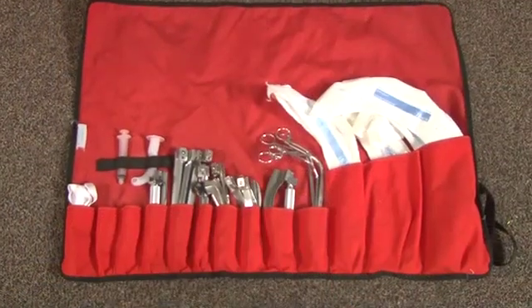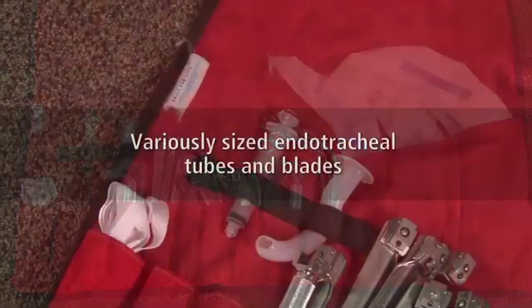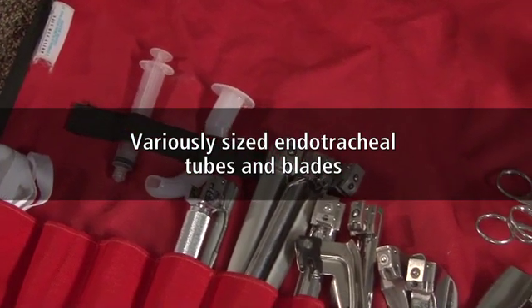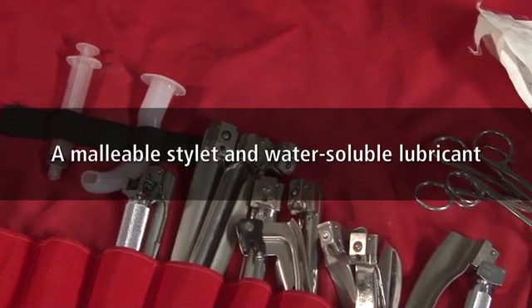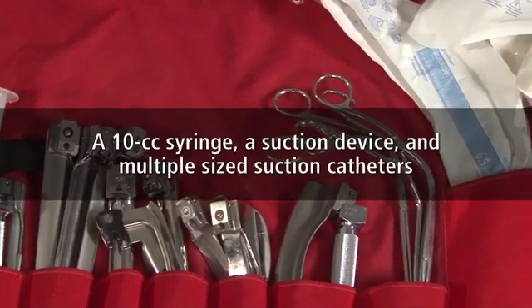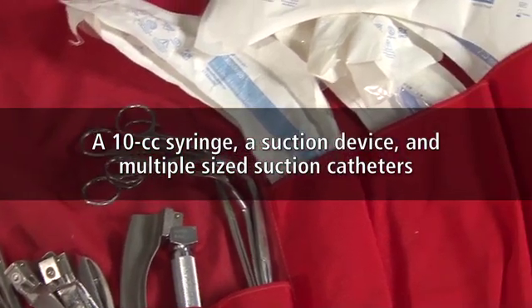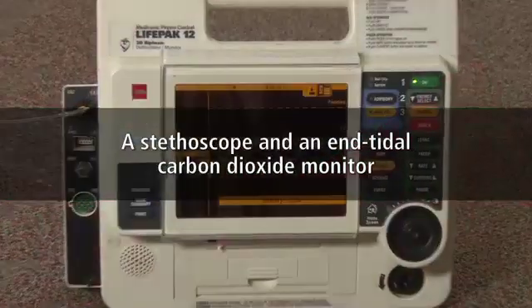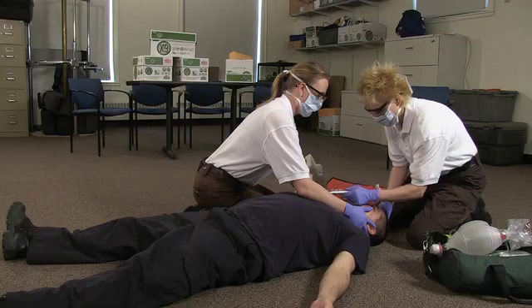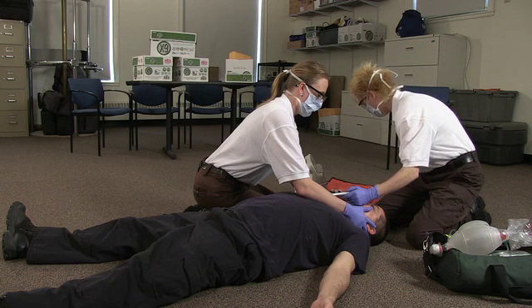The second provider assembles and tests the orotracheal intubation equipment, which includes a selection of variously sized endotracheal tubes, a selection of variously sized blades, a malleable stylet, water-soluble lubricant, a 10 cc syringe, a suction device, and multiple-size suction catheters, a stethoscope, and end-tidal carbon dioxide monitor. The proper sized endotracheal tube, based on the patient's size, is selected.